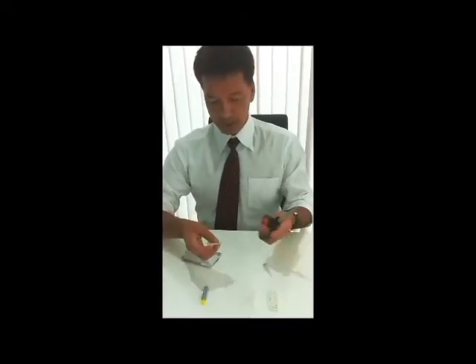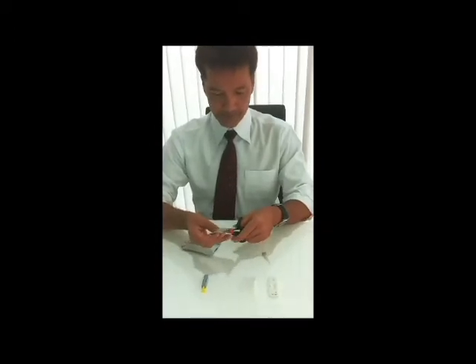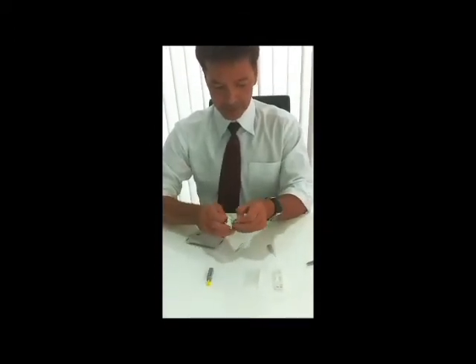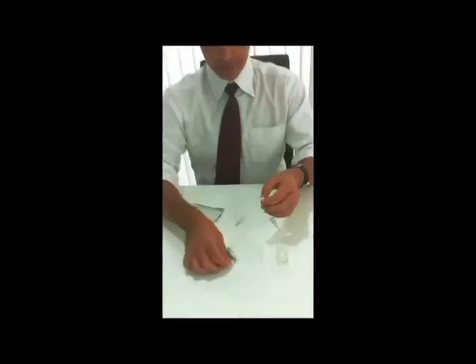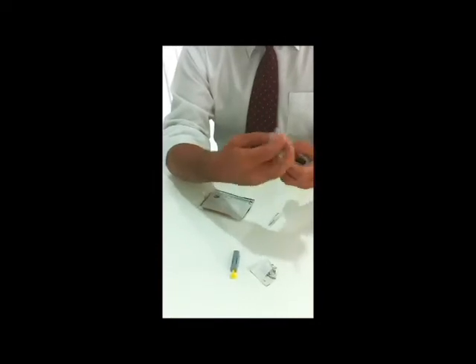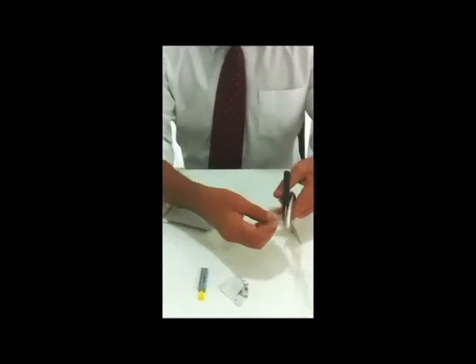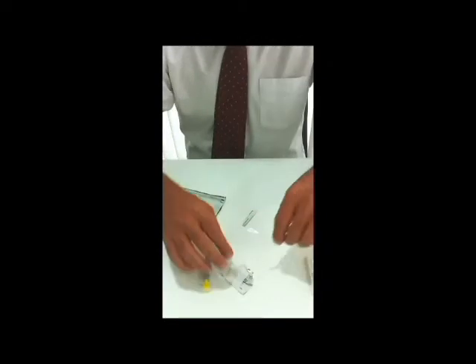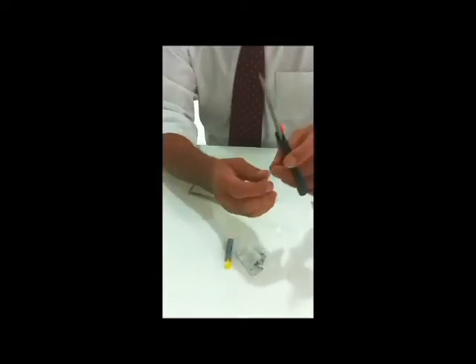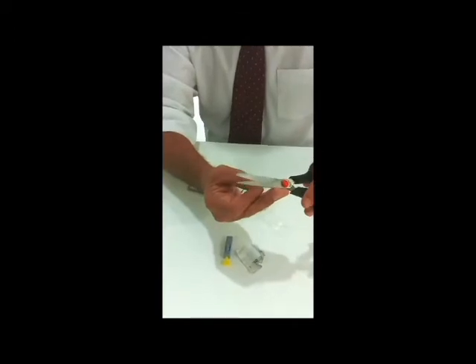The first thing we do is to open the alcohol swab kit and have it on standby, ready to use. Also have the buffer bottle ready to use. You can even go ahead and take a small snip of it at the top as you go.